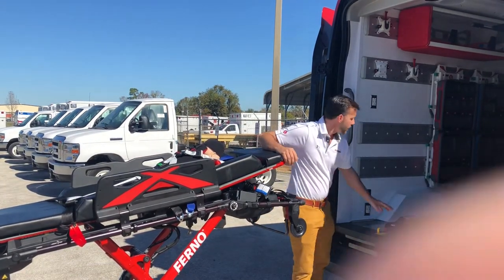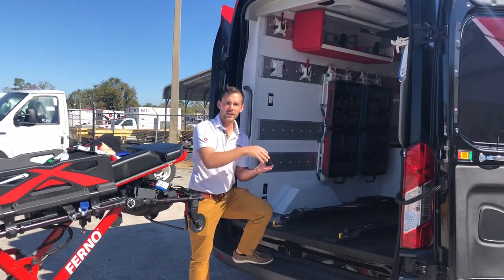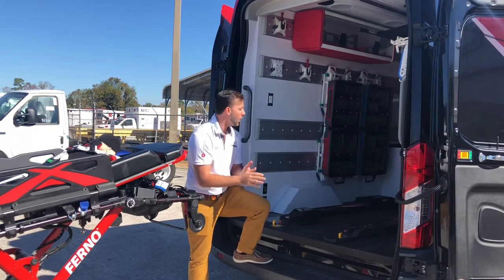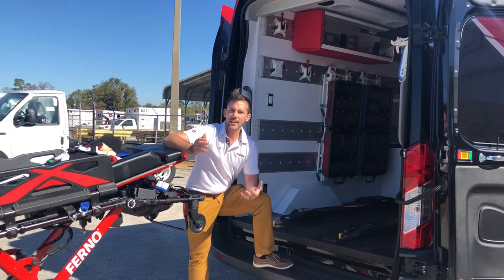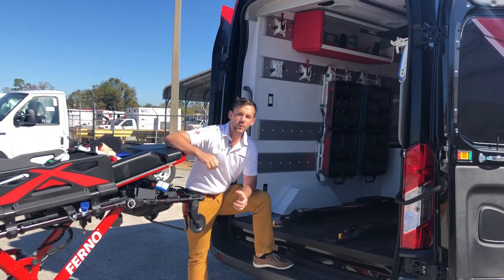This is our Pro F1 Fastener. We have two options: you can go with integrated charging, which will charge it as soon as it's in the truck, or just standard fastening. We can also add your antler lock bar. So if you had any older stretchers and wanted to use one, that could also fit in here as well.